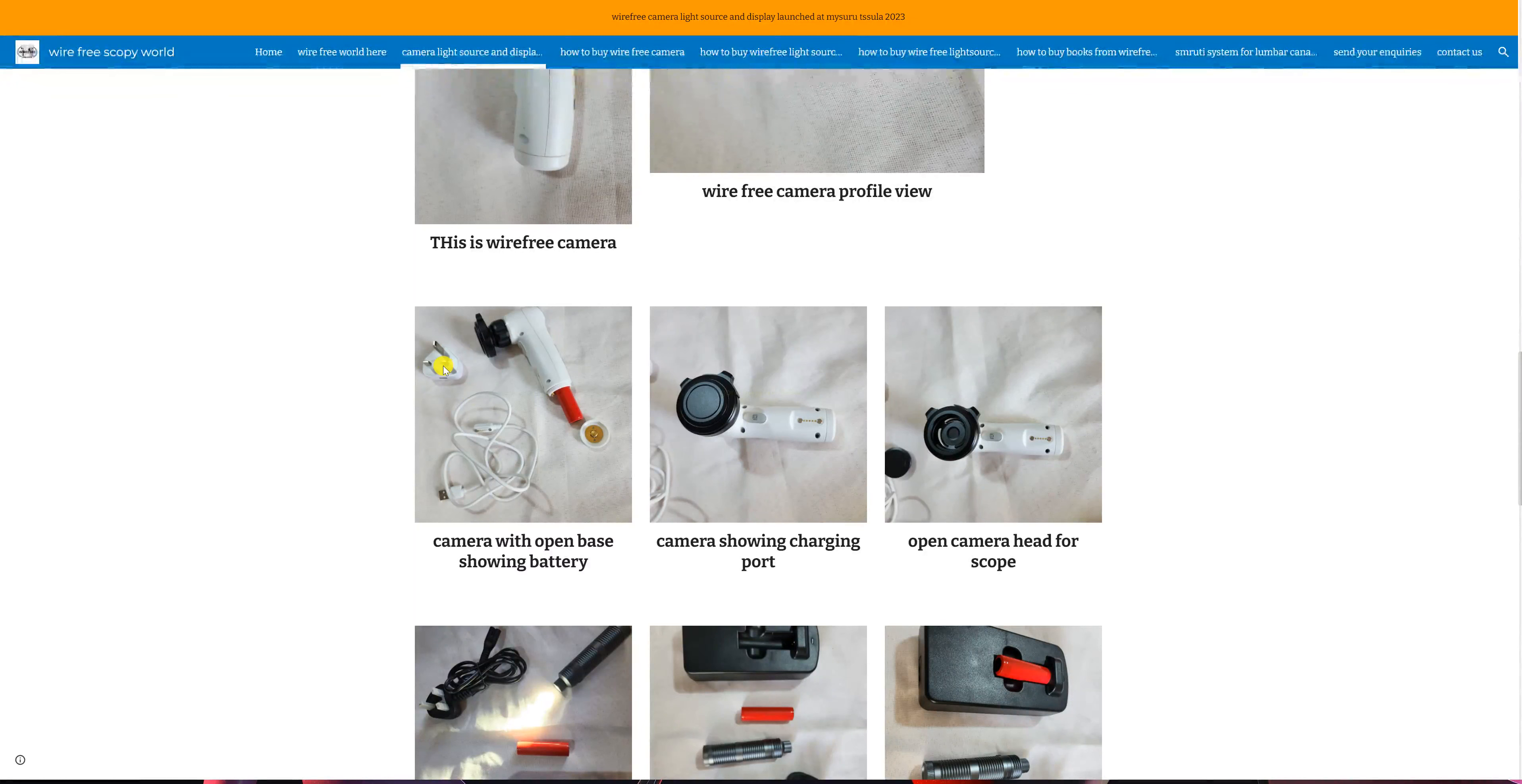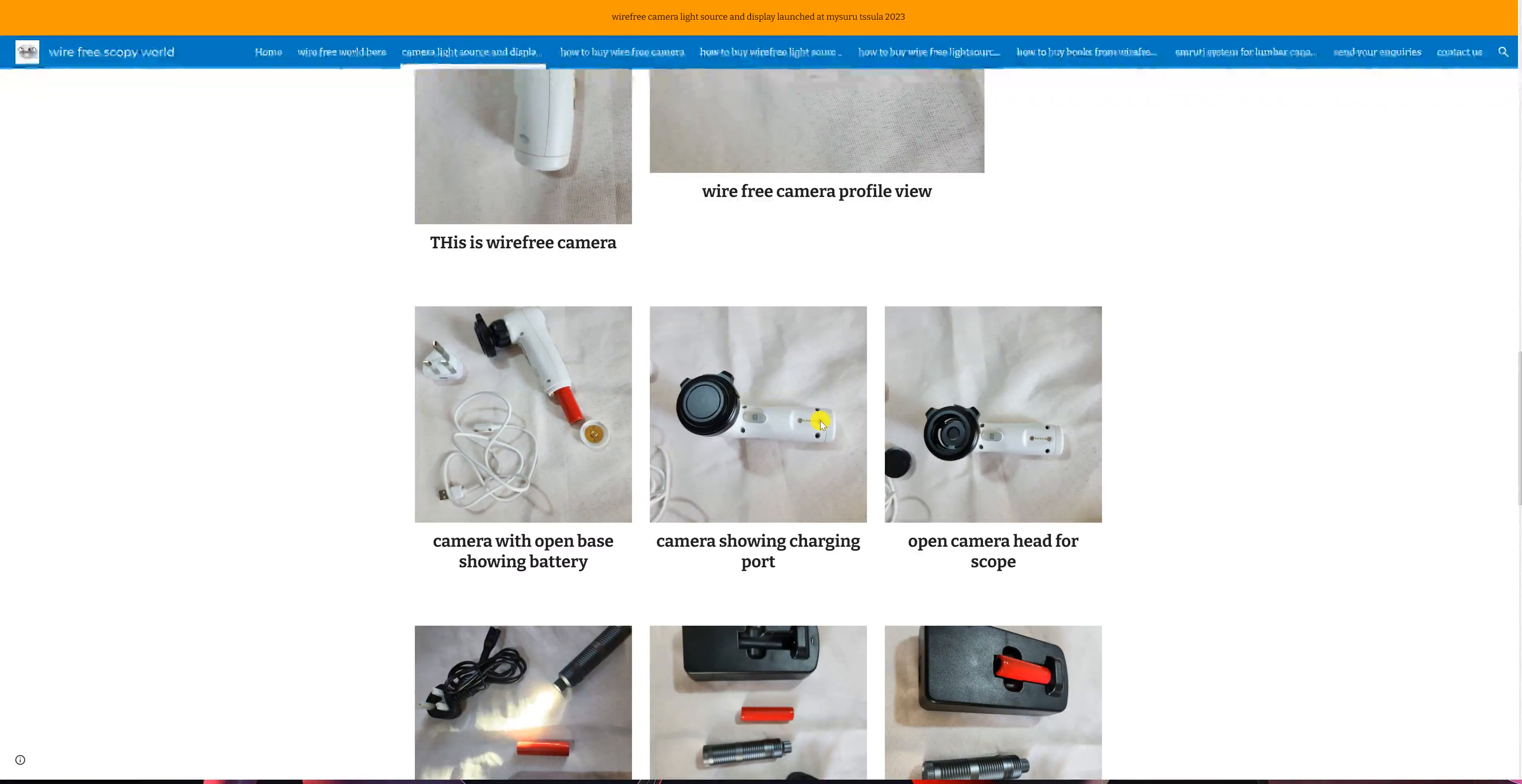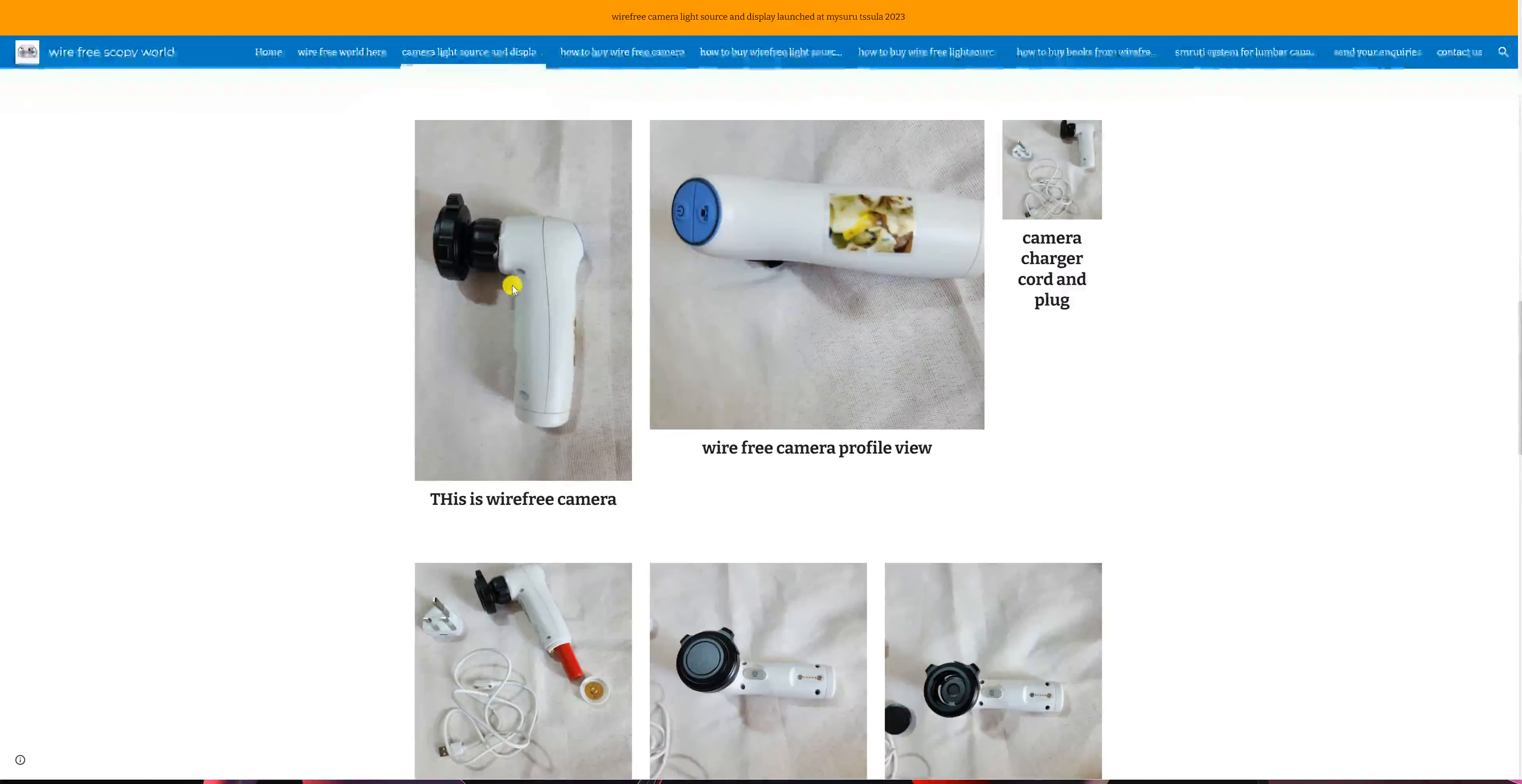This is the plug pin. There is a hole for USB where this will go in, and the other end, these two dots which you see, will fit here. This is the charging port. Now this lid comes off when you press these two ears of the camera, and you can see the open head of the camera which accommodates the scope. This button which you see here is used while working.